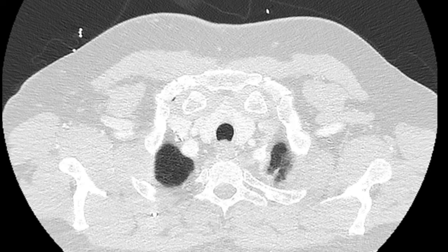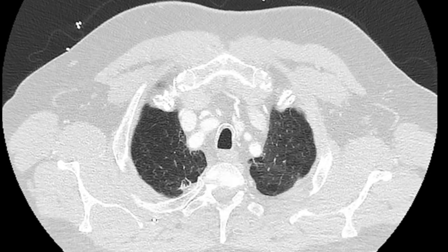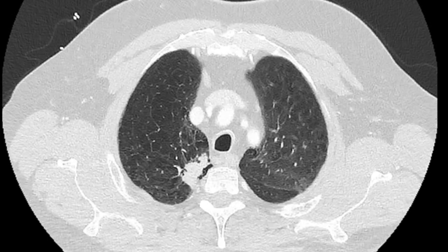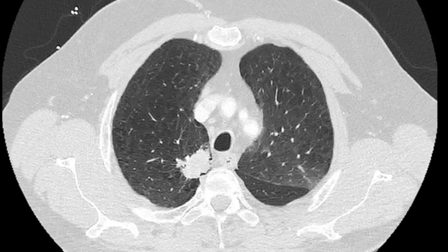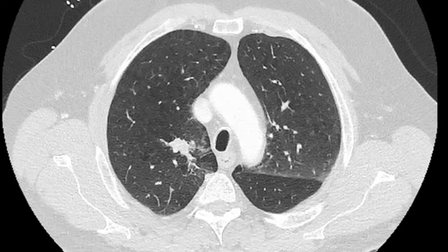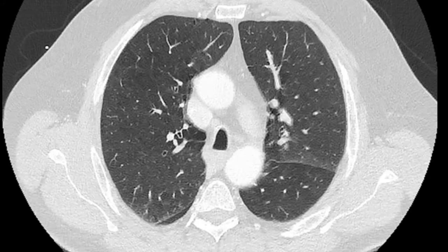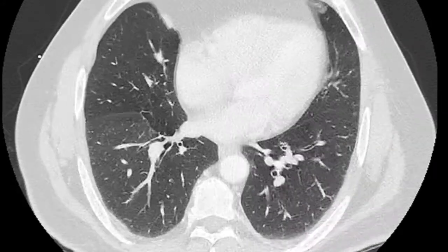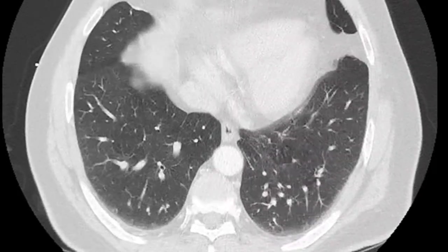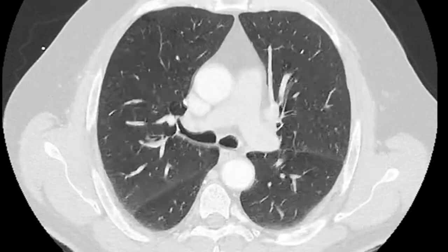This is a case study of a 64-year-old man who was an ex-smoker and presented with cough. The CT scan of the chest shows a little bit of apical emphysema, and as you come down you can see this apical lung lesion sitting right at the top of the right upper lobe posteriorly, with another small nodule just there. Scrolling down, despite some movement artifact in the lower lobes, there's no other lung lesion.